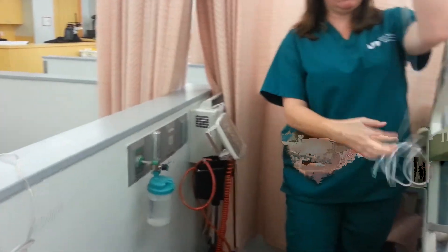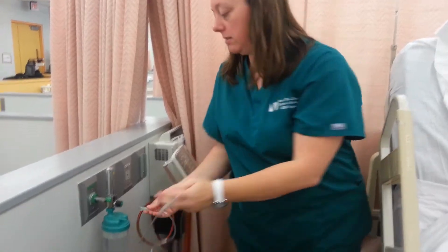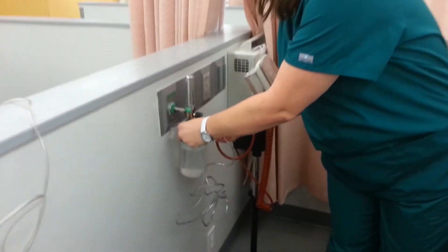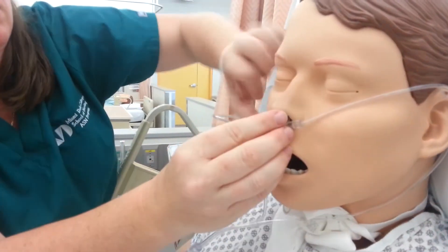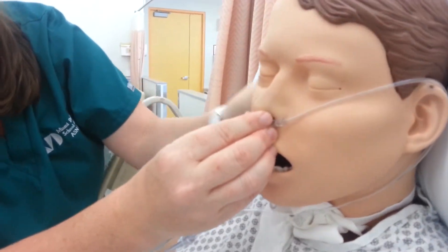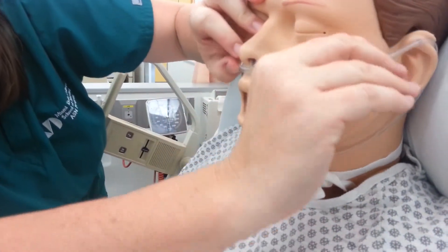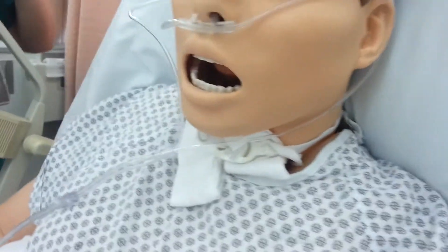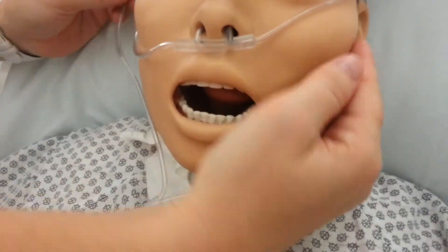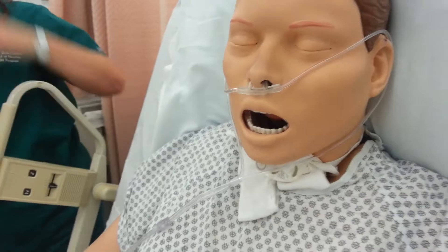Just one tube — it has these little snake-like things that go down. You do this part the same. Get it this way — they don't always go in very well. But she understands it doesn't always stay well. That's the general gist — that's the nasal cannula.